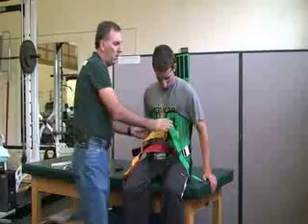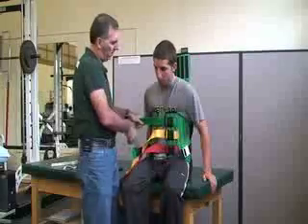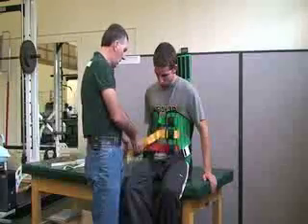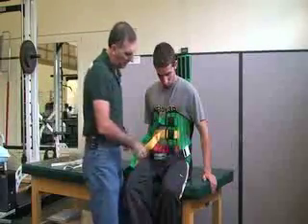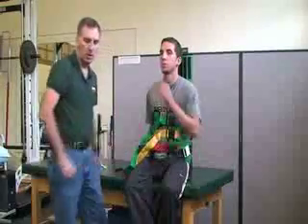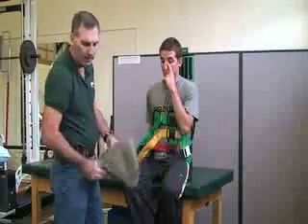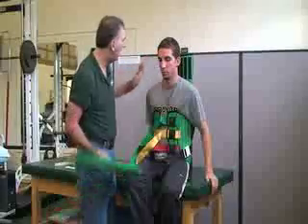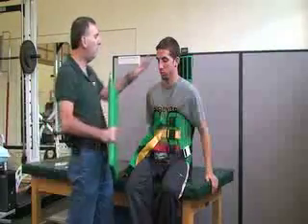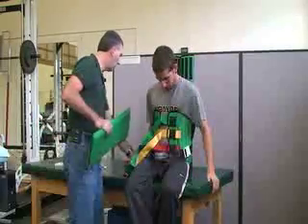Each one of these buckles will be tightened. Communicate with the patient to make sure it's snug. The next piece is the head section, which is also velcroed. If needed, you can add some foam padding behind the neck, especially for a smaller person, or a towel to help add a little more support.